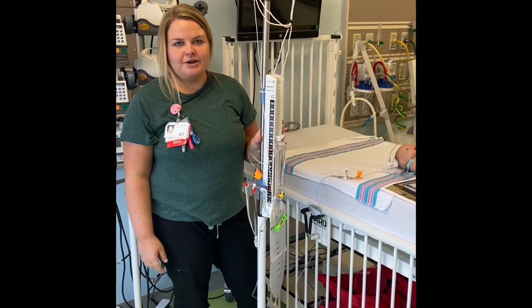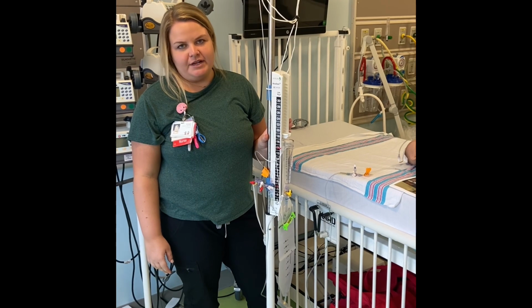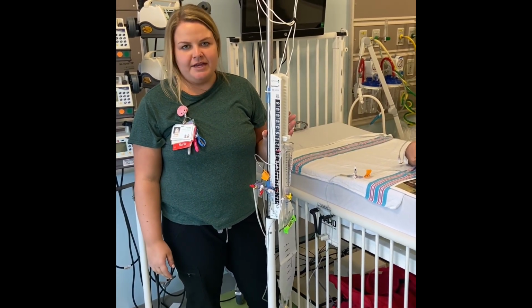This video is going to go over zeroing, transducing, and trending on your EVD. So first we're going to talk about zeroing your EVD.